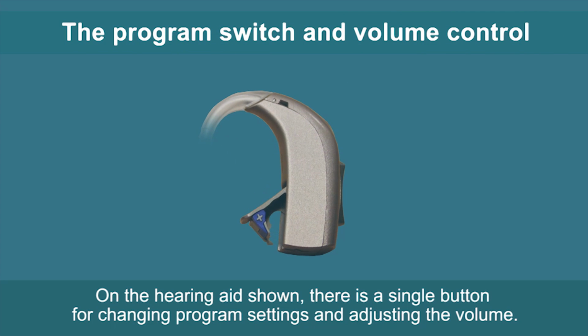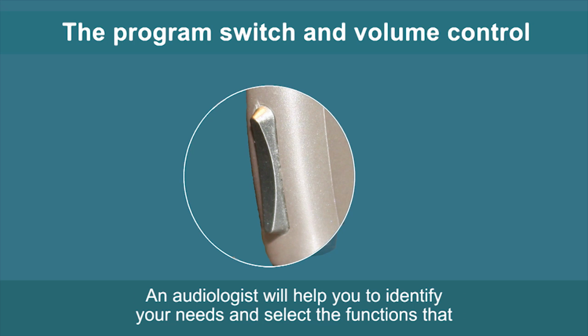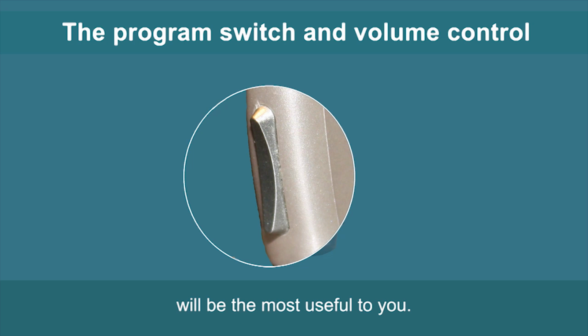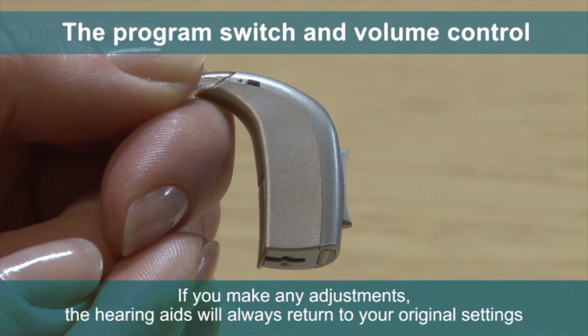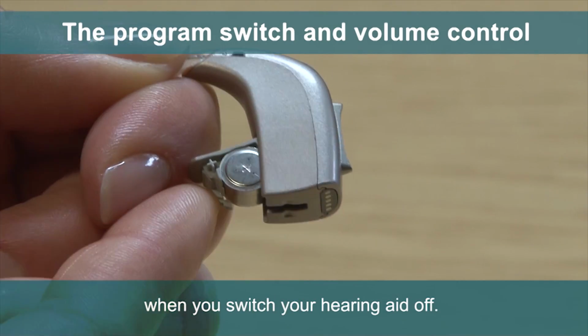The program switch and volume control. On the hearing aid shown, there is a single button for changing program settings and adjusting the volume. An audiologist will help you to identify your needs and select the functions that will be the most useful to you. If you make any adjustments, the hearing aids will always return to your original settings when you switch your hearing aid off.